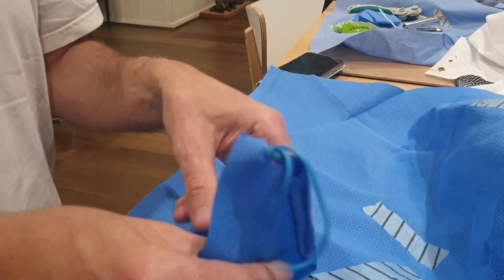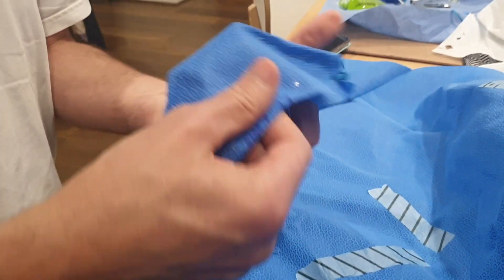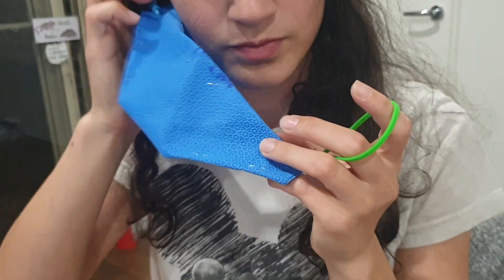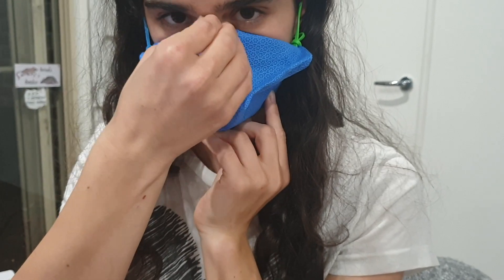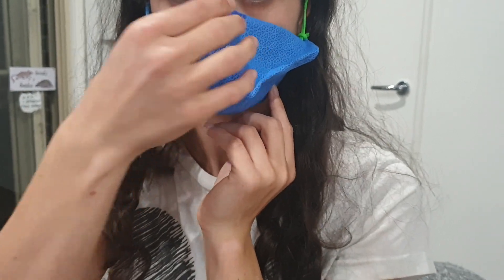The mask is now complete and ready to be worn. To put the mask on, simply loop the two rubber bands around your ears and then tighten the mask at your nose bridge in order to create a better fit.